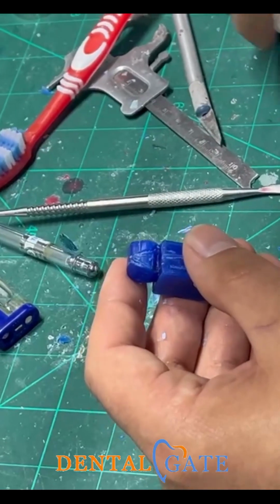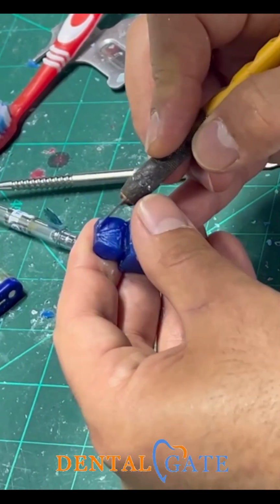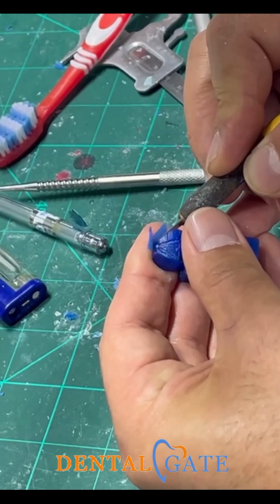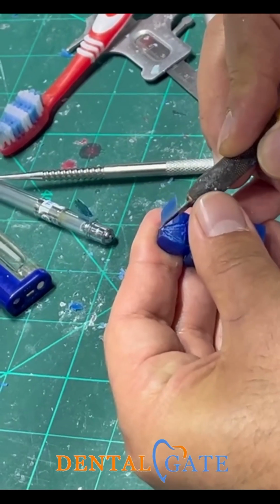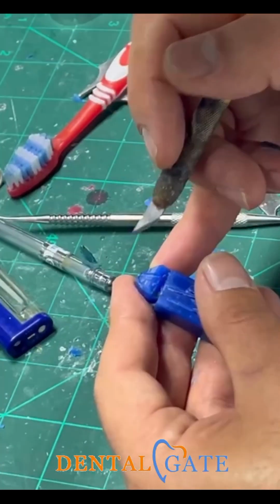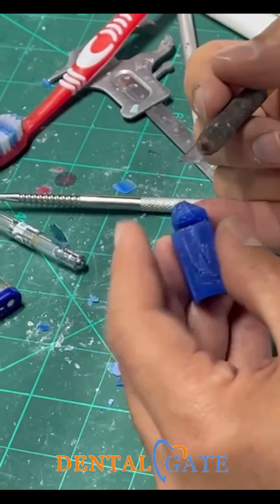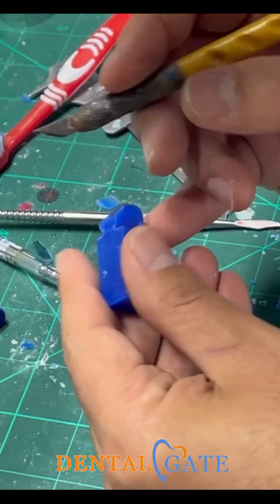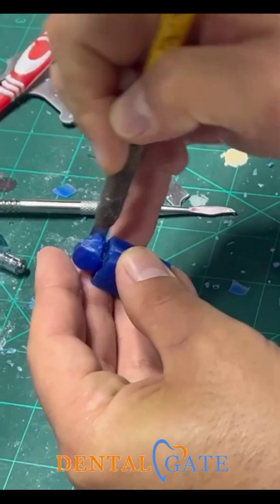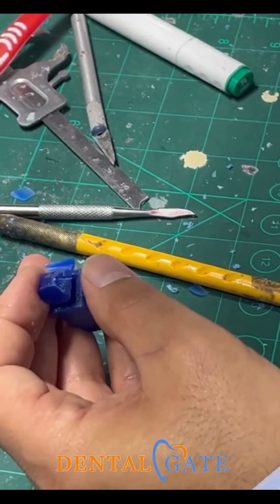So you can make a double check and now start removing the excess of wax, according to the outline, according to the lines, according to the shape of the lateral incisor from the distal aspect or mesial aspect. Don't make a severe slicing, but I will start it to preserve the time.